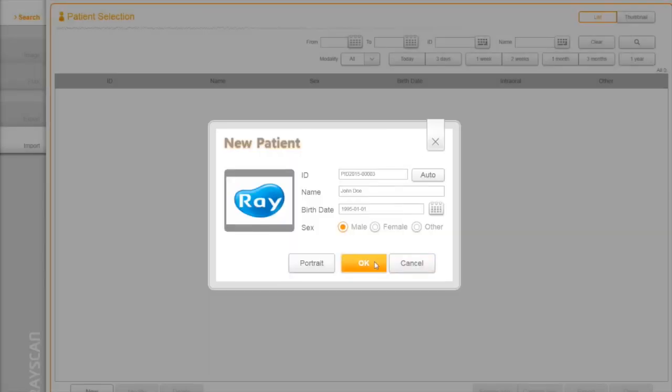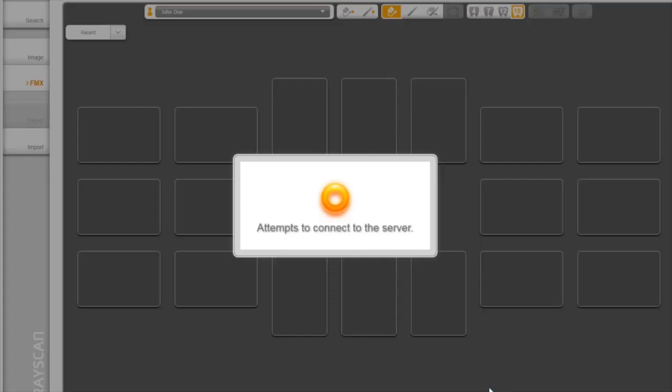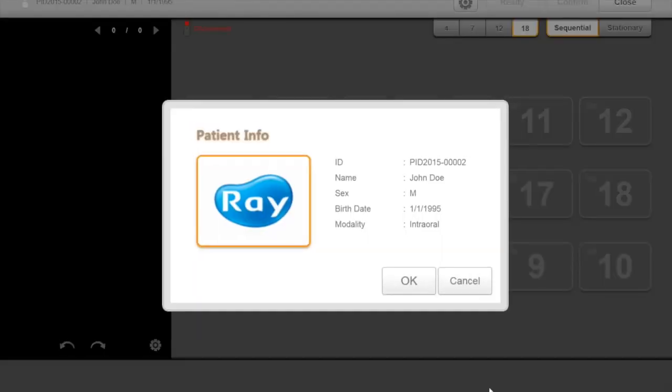Once the sensor acquisition is selected, the window will be switched to the acquisition view. You can also export and import patients' images in RIO view, and it will be covered later at the end.